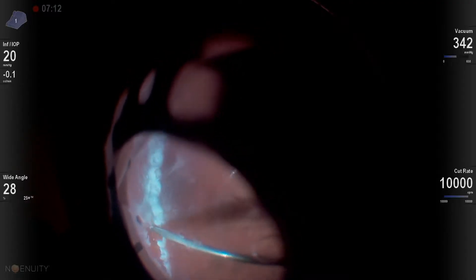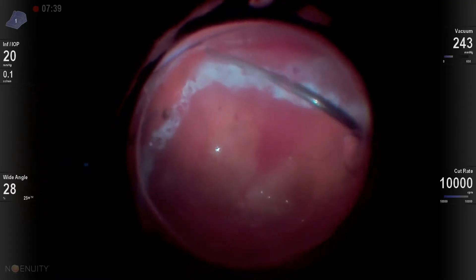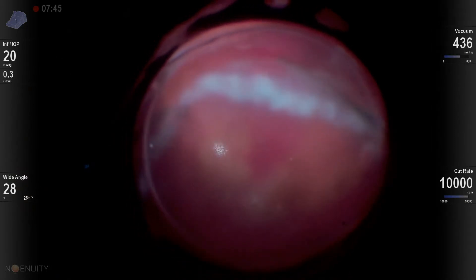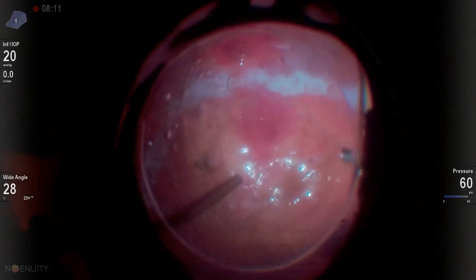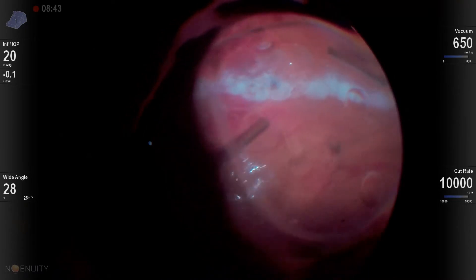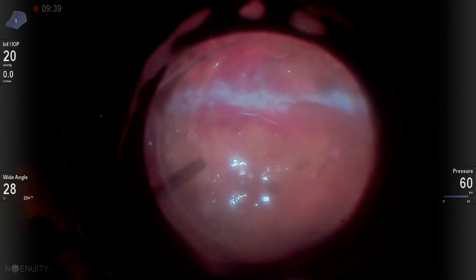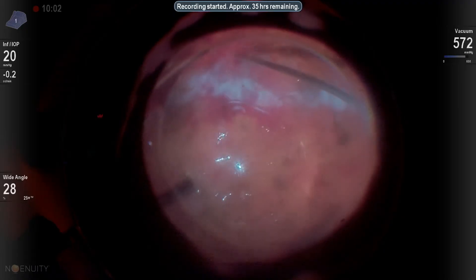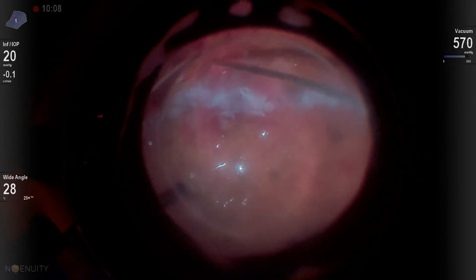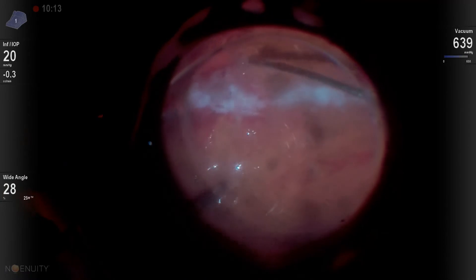When making a retinectomy under oil, you want to be very generous with the size, as with every retinectomy. Infuse oil into the eye and get your pressure up to about 45 or 50 — that prevents any bleeding. You will have to go back and refill with oil as you're doing more and more of the retinectomy. The real key is to keep your cutter port underneath the retina as much as you can and just come up and barely nick the retina to make your retinectomy and move on. You don't want to spend a lot of time in the oil or your cutter will get occluded.